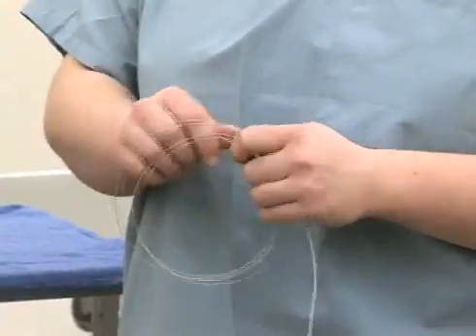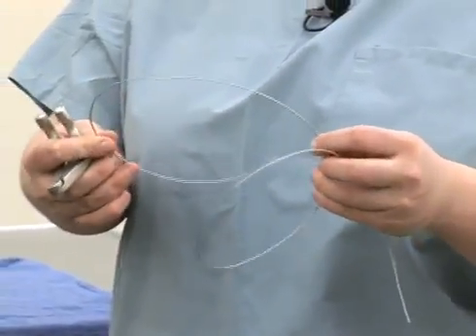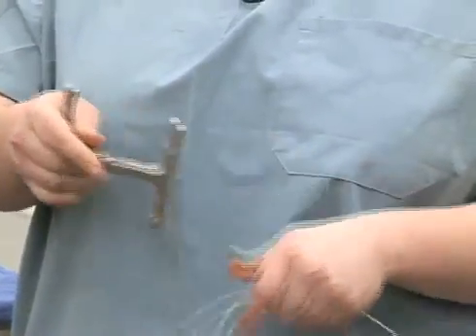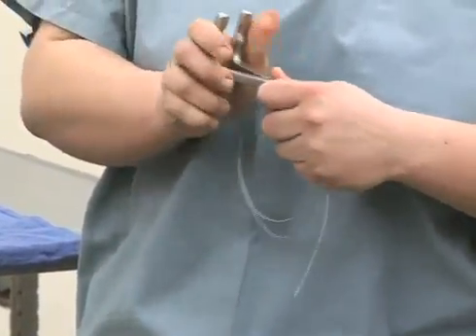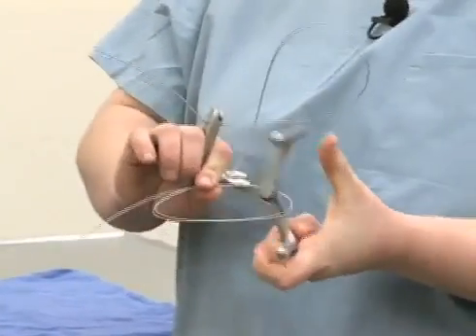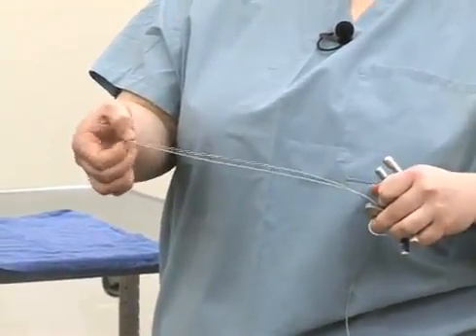The equipment we typically use to perform this in a standing, non-sedated animal — which is very easily done at home by owners — is giggle wire, or obstetrical wire, that can be readily purchased at most farm supply businesses, along with handles that allow you to clasp the abrasive wire and provide a safe surface for handling it while applying pressure to the tooth. You'll have one handle in each hand, and the wire surface in between goes back behind the tooth, providing the cutting surface on the inside of the loop.